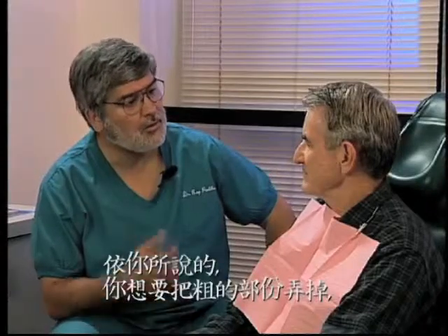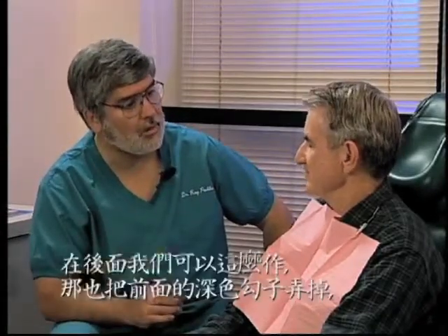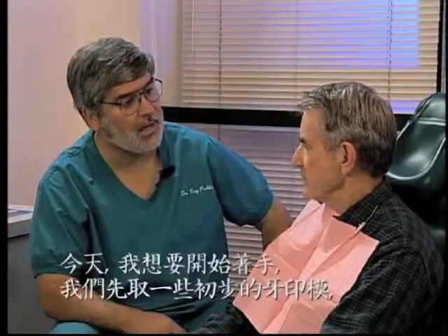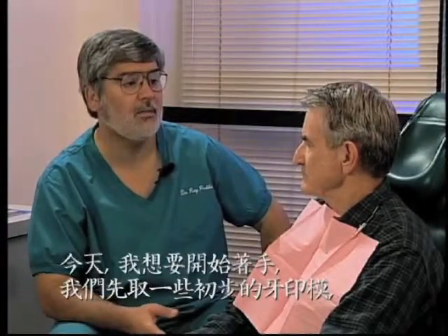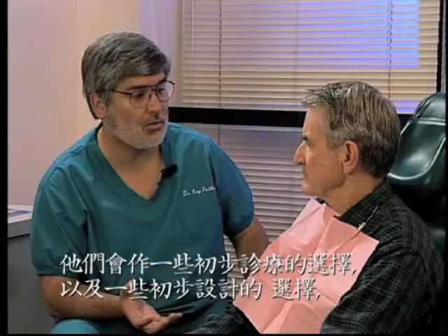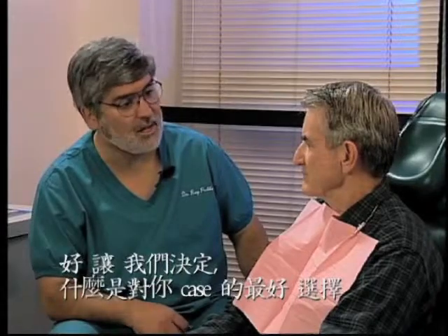What we can do for you is, you mentioned to me that you want to get rid of that thickness in the back of the mouth, and also get rid of the dark hooks up here in the front. We can help you with those options. What I'd like to do today, let's go ahead and get started. We're going to take some preliminary impressions, some molds of your mouth. I'll send those to the laboratory, and then they can do some preliminary design options for us, so we can decide which option would be best in your case.